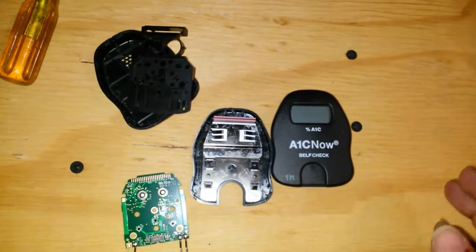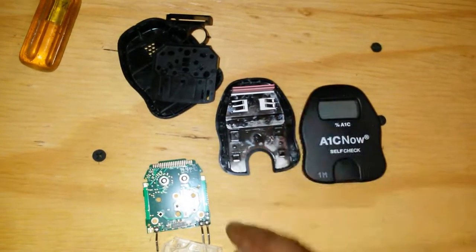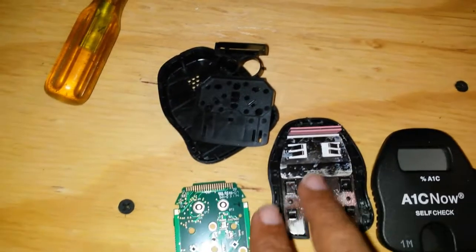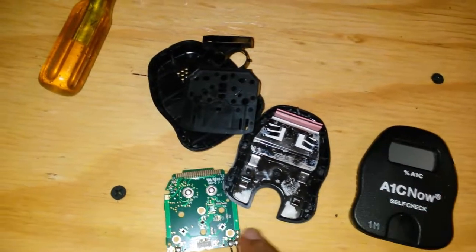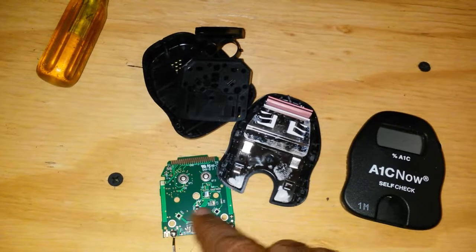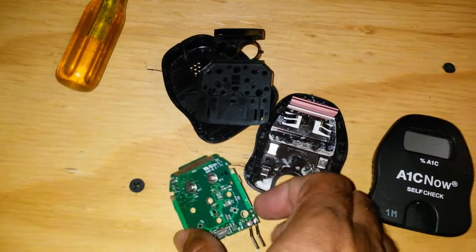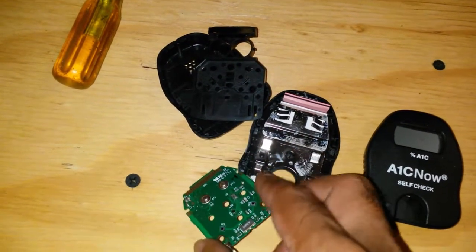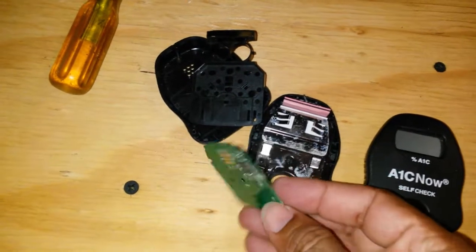Apart from that, there's not much else that I could figure out on this. It's some optical method. Essentially, you plug the strip in. There's a little procedure, and you could check online and see what the procedure is on that. You wait a certain amount, and you put a different thing, and you plug the sample in here, and there's two tabs. Essentially, I believe these are two optical CMOS or some type of sensor like that, and it determines an optical change that would occur based upon a chemical reaction, and that does the initial processing. I can see from here where I damaged those wires. Probably the initial processing, then this BGA package does pretty much everything else, and the display.